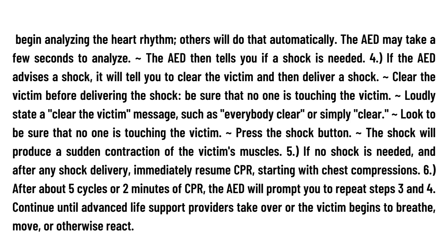Press the shock button. The shock will produce a sudden contraction of the victim's muscles. Step 5: If no shock is needed, or after any shock delivery, immediately resume CPR starting with chest compressions. Step 6: After about two minutes of CPR, the AED will prompt you to repeat steps 3 and 4.